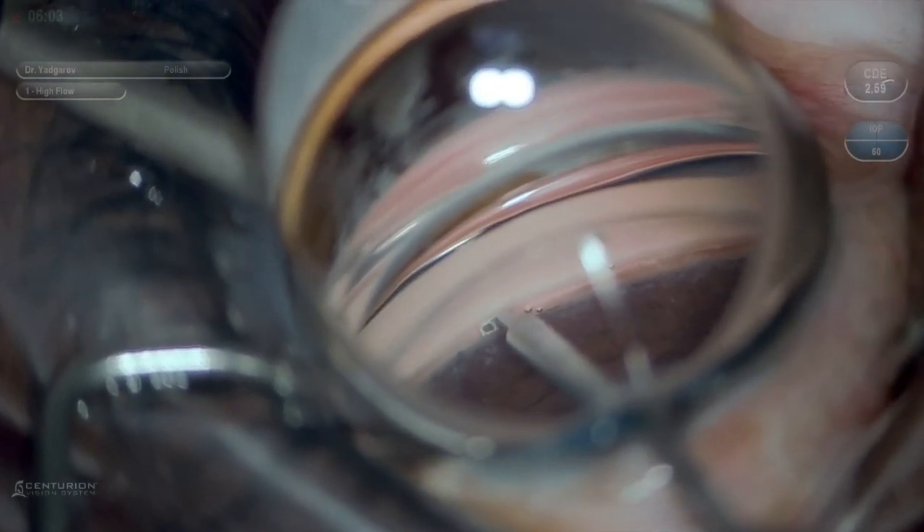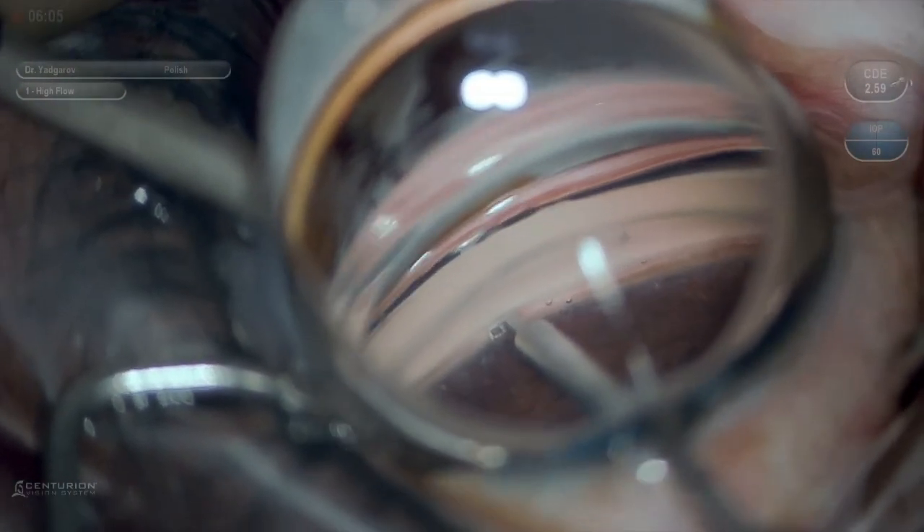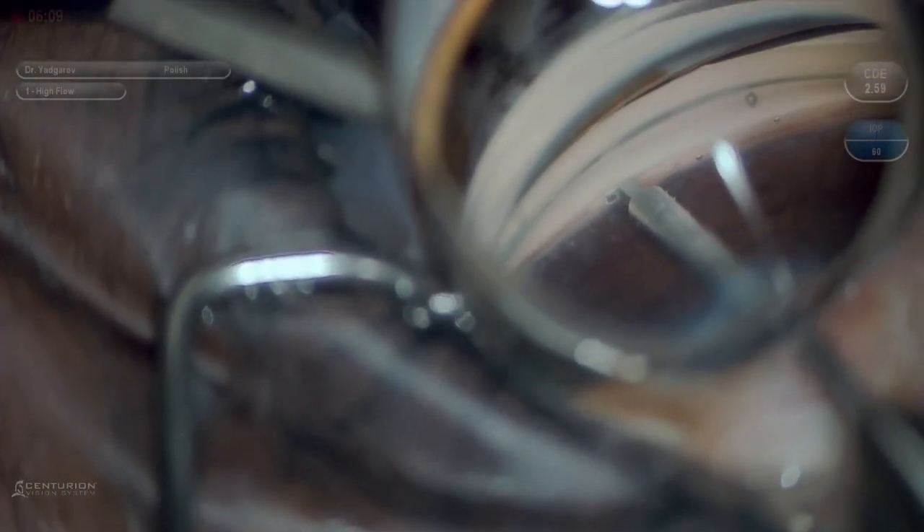Usually toward the end of the goniotomy procedure, you remove the goniotomy device and there is a long strip of meshwork. You could either leave it in place or remove it with micro forceps. What is unique about the Scion is that it actually will grasp the tissue within that trap and amputate it, as you just saw being done here.